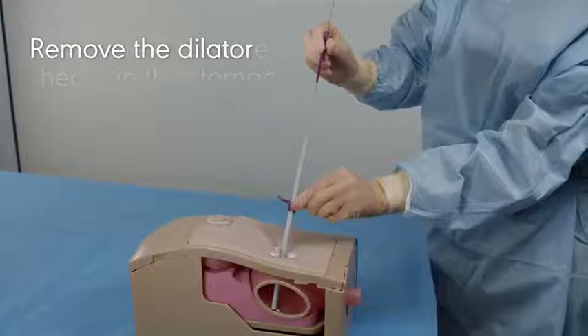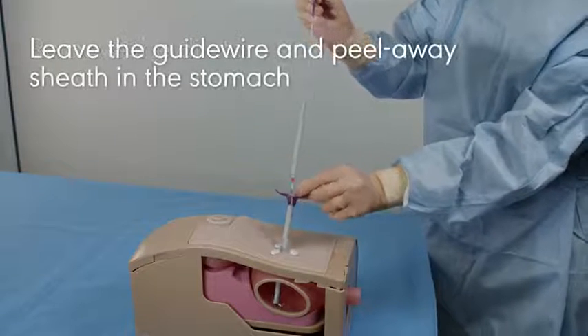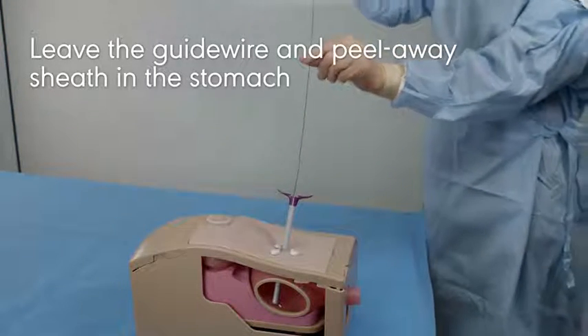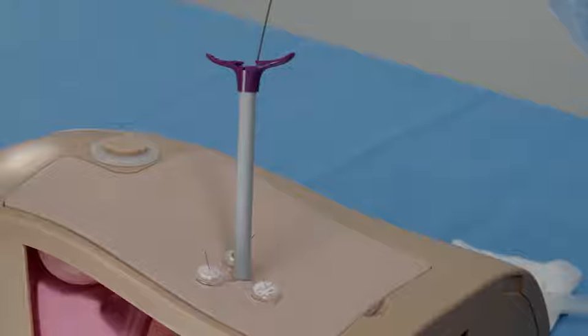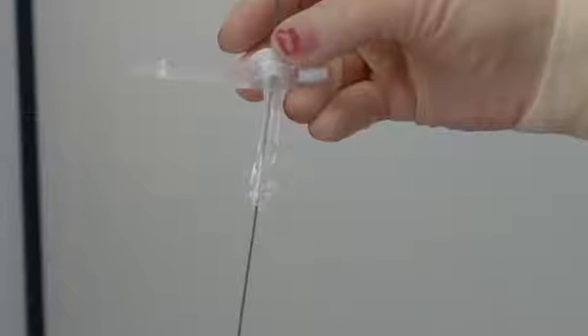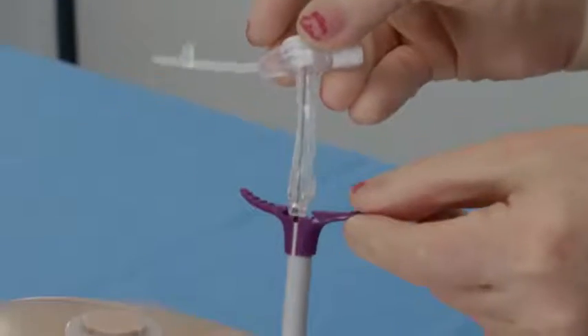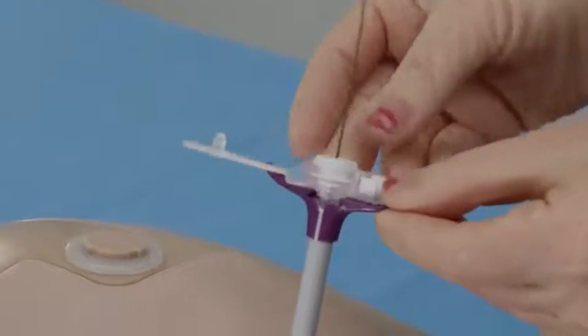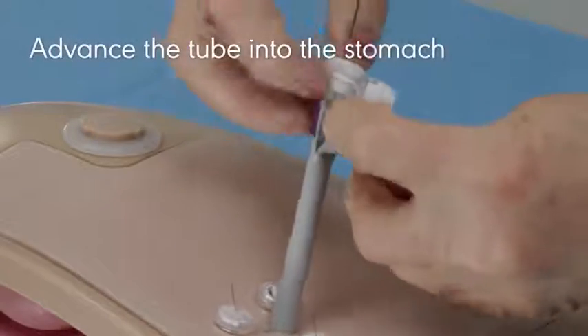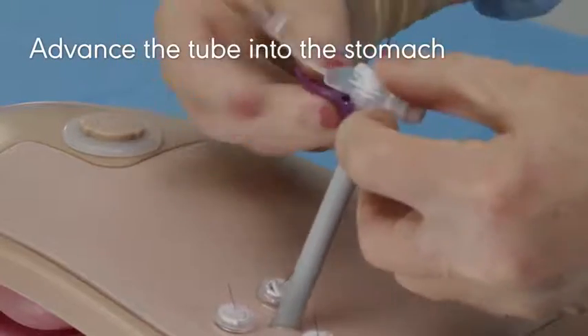Remove the dilator, leaving the guidewire and peel-away sheath in the stomach, with the remainder securely maintaining position in the tract and exiting the stoma site. Select the appropriate Avenos MIC or MICI enteral feeding tube while maintaining stomach and stoma tract access via the pre-positioned peel-away sheath. Advance the tube down the peel-away sheath and into the stomach.